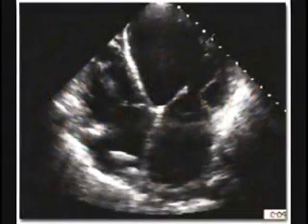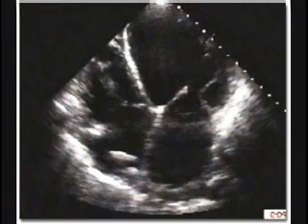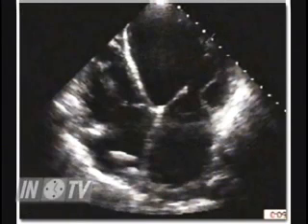So now we're getting into echo here, is that correct? Yes. That's correct. And this, let's see, is transthoracic echo. So what are we looking at here? We're looking at a section through the heart from the top? This is the bread and butter test for cardiologists. And this gives us so much information about the anatomy of the heart and the physiology of the valvular lesions. It doesn't say much to us about the coronary flow.